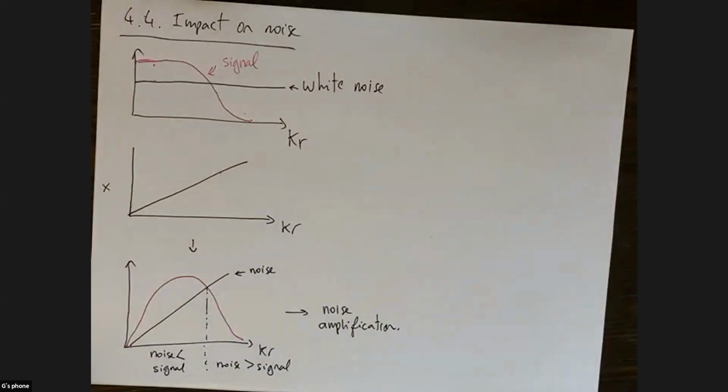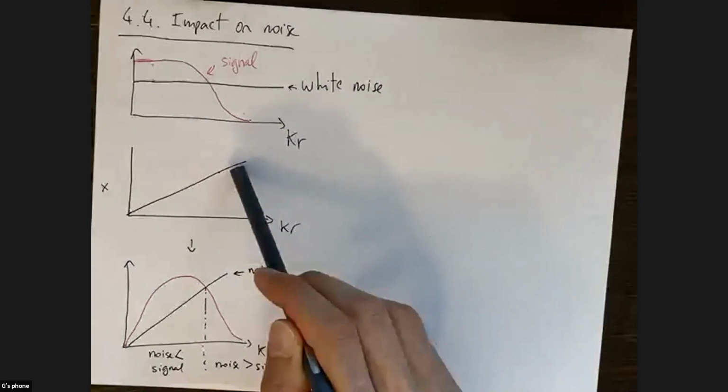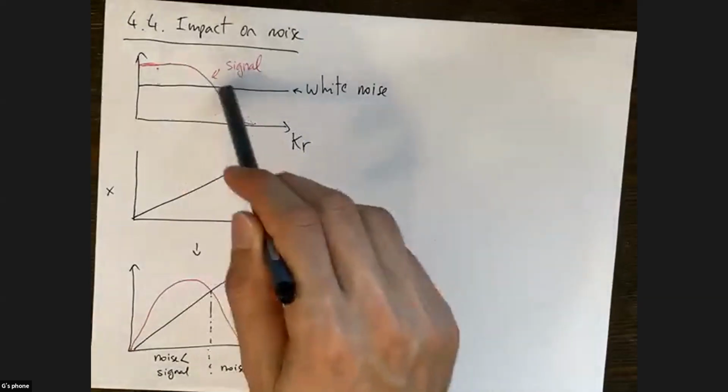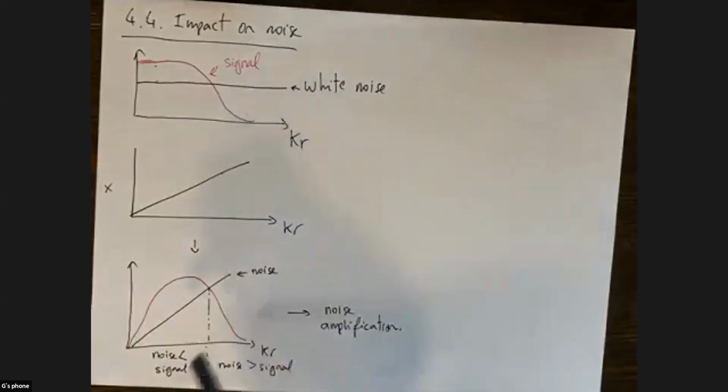So we had mentioned that by backprojecting the data, we're emphasizing low frequencies compared to high frequencies, and by multiplying by the ramp filter, we're trying to rebalance the different frequencies, and we do that by emphasizing the high frequencies. But the problem is that by emphasizing the high frequencies, we emphasize the component of the noise which is in the high frequency, right? If we were to do nothing, the images would be very noisy and they wouldn't be very useful. And so that's why we need to implement another approach to get usable images, which is to incorporate a gradual roll-off in the ramp filter.